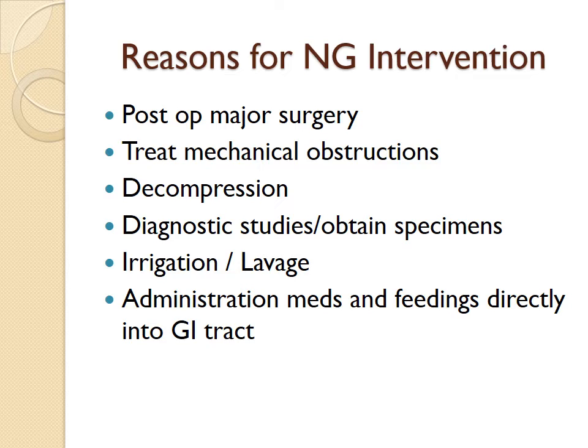Now, if you're looking at diagnostic studies and obtaining specimens, sometimes the tube is needed to instill medications that may either be uncomfortable to swallow or that can irritate the esophagus. Maybe they have a foul taste, whatever the reason. Or it may be to obtain some kind of very specific stomach contents for diagnostic purposes.